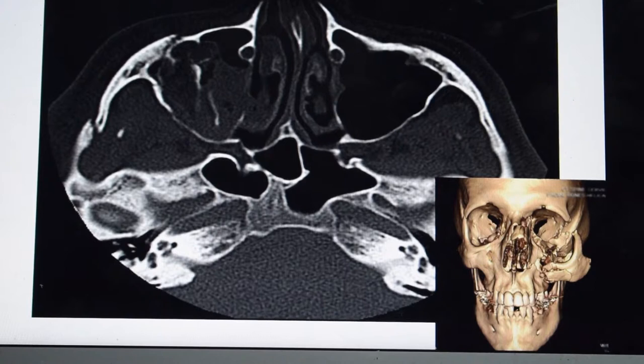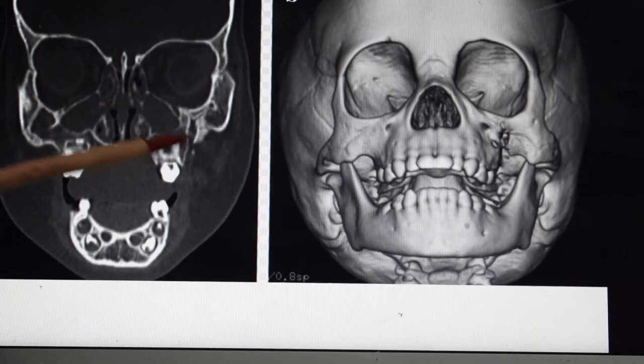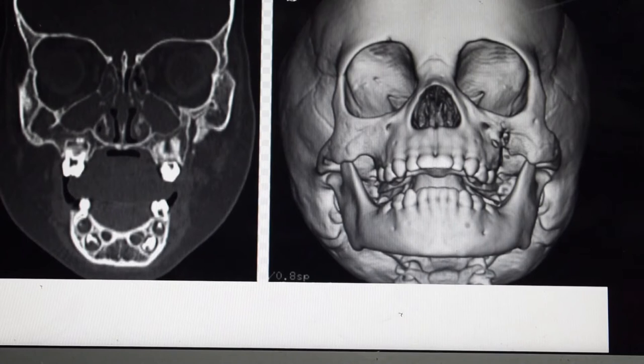Moving to another cut, you can also see a fracture line here at the maxillary zygomatic buttress. Here is the fracture line; on the other side it is intact, but here the continuity is not there. So this is the fracture of the zygoma — another cheekbone fracture.